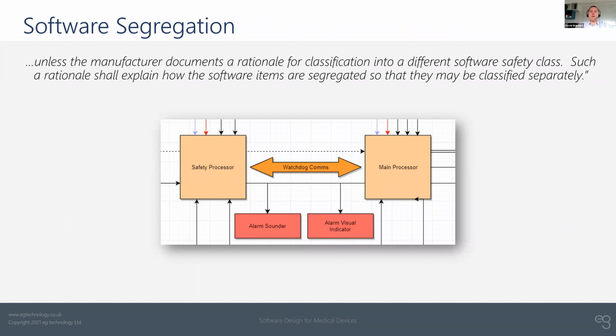So the first thing that we do when we're thinking about a project is consider whether the risks arising from the software can actually be mitigated in hardware. If there are hardware controls that you can put into place, then this is a good approach. If you have easily measurable parameters where a cutout type function can ensure the worst risks are mitigated, you might then be able to bring the safety classification of your software down because it's doing progressively less safety critical aspects of the work.